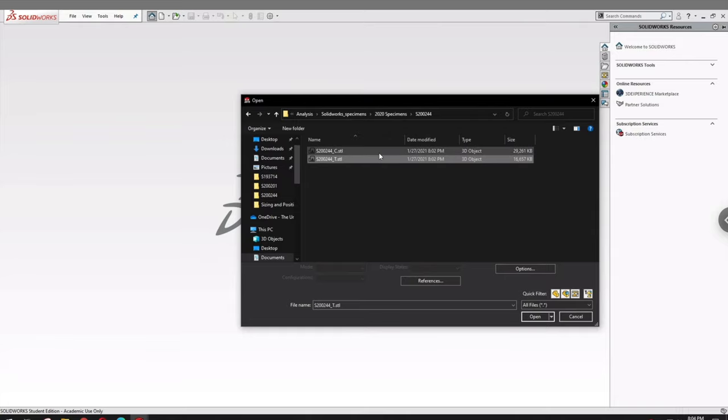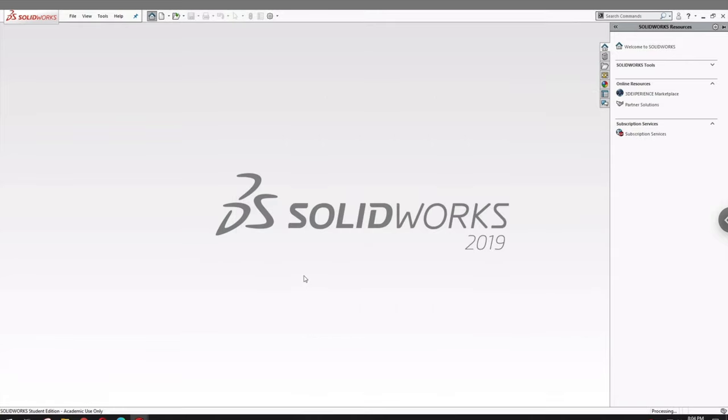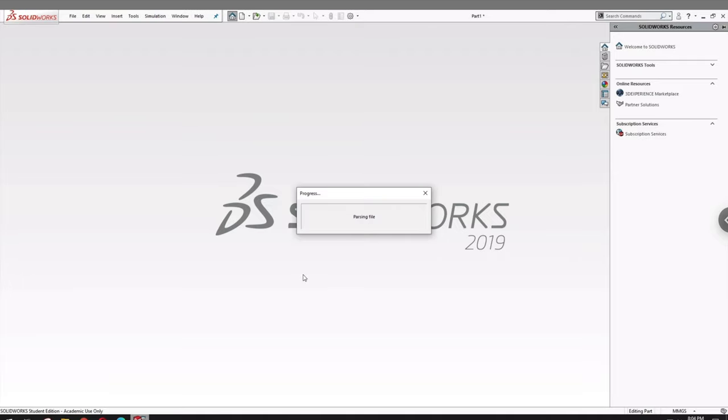So just as we're finishing up here, to open these models in SOLIDWORKS, ensure that you're using the internal open function native to SOLIDWORKS and you're not just clicking on those .stl files. Now, unfortunately, this parsing and processing step is deceivingly long, and at least I found that when I was originally doing this process, I would assume that it wasn't actually working, but if you have enough patience, it should ultimately give you solid bodies that you can convert into SOLIDWORKS parts.